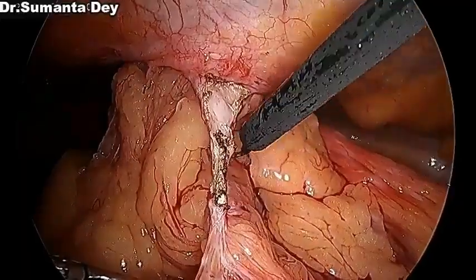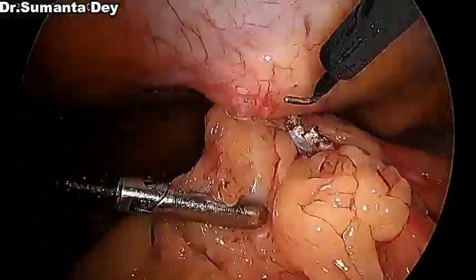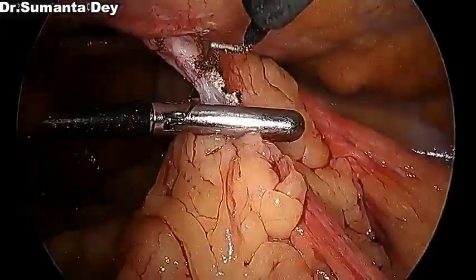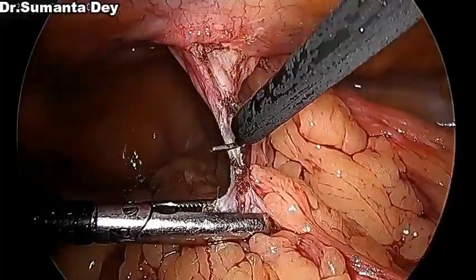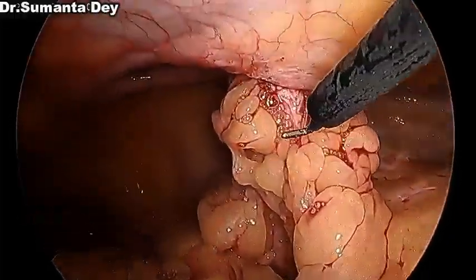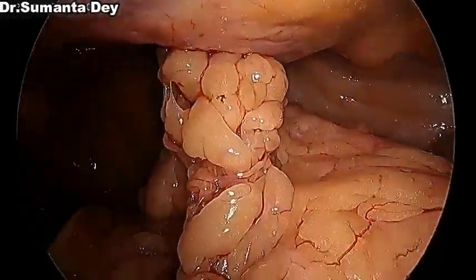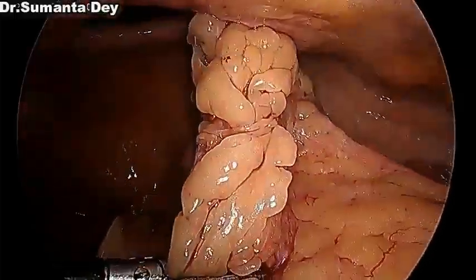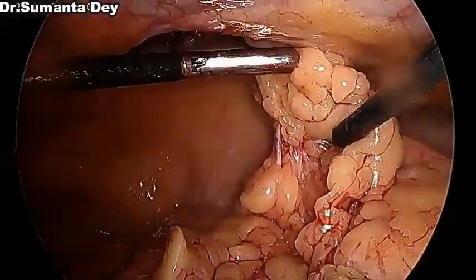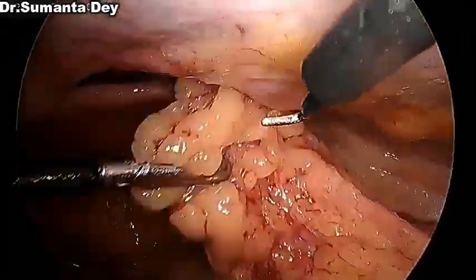While reducing the hernial content, if you are planning for a TAPP plus procedure, you should take care that you do not injure the peritoneum adjacent to the hernial defect, and be very careful, because if you injure the peritoneum around it or inside the hernial defect, then while you lift the peritoneum for TAPP, there will be rents, which you again have to close at the end of the procedure.